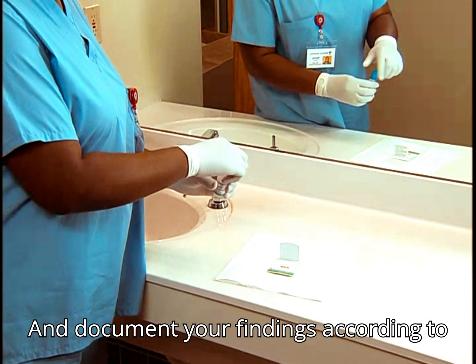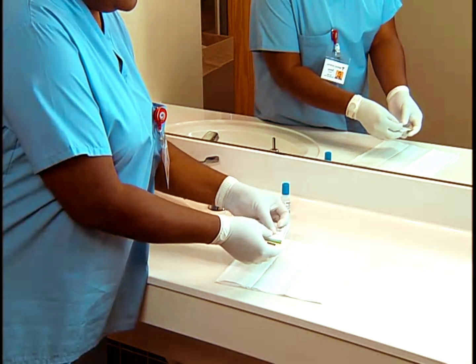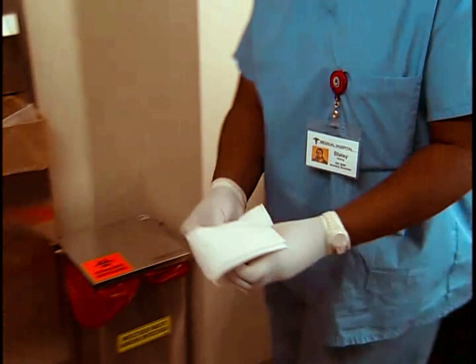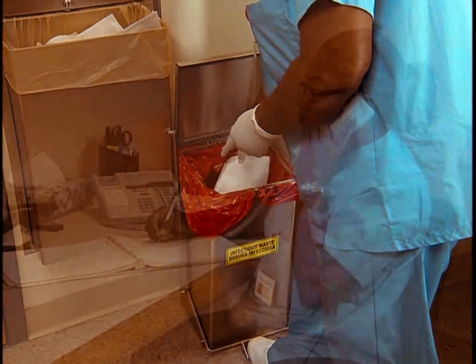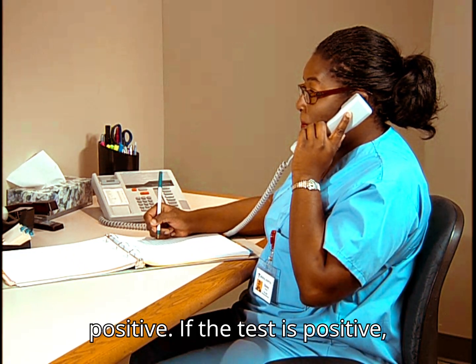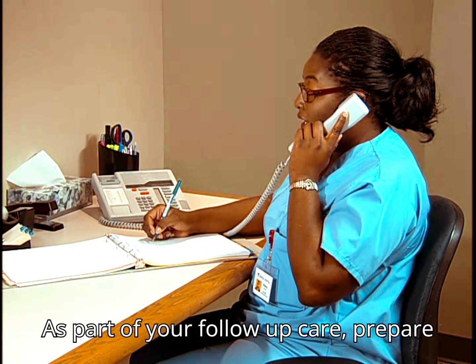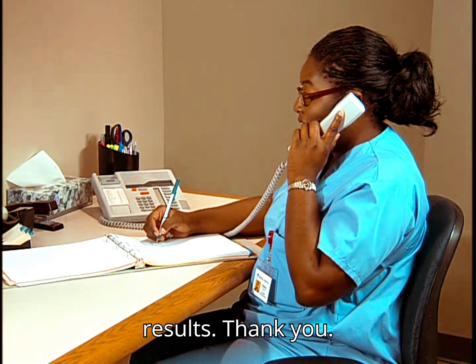Document your findings according to facility policy. If the test is positive, report the results to the physician. As part of your follow-up care, prepare for repeat testing to confirm the results.